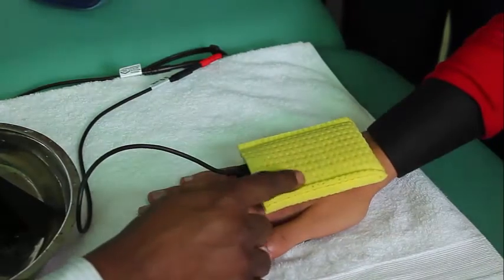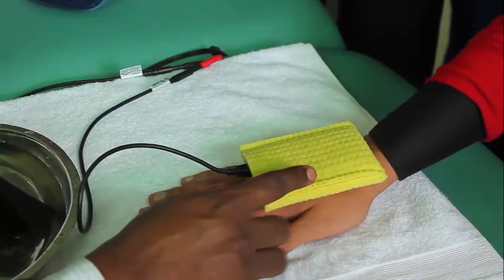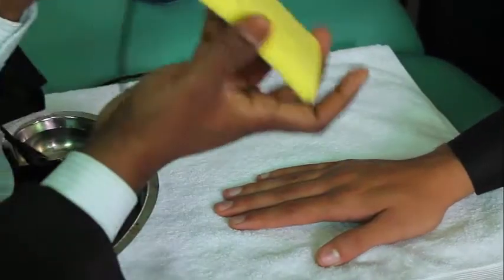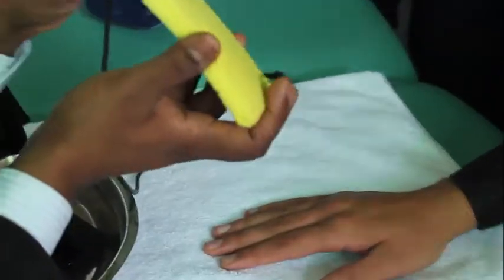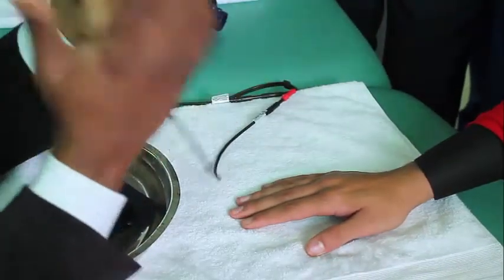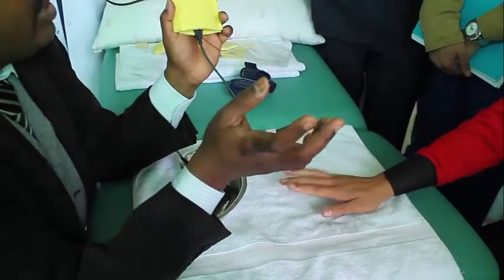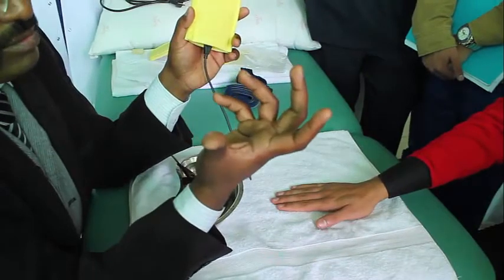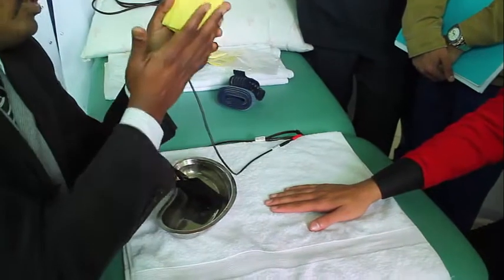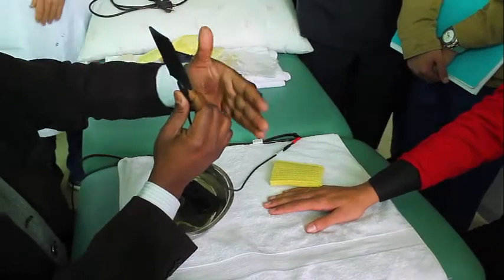So now this is one way of decreasing the skin resistance: apply the water, dip the sponge material inside the water, and put 2 layers of sponge between the electrode and the skin. This is one method. Second method, if you don't want water, if water is very messy, some patients don't like it, at that time you use gel. There is liquid gel and there are gel electrodes.